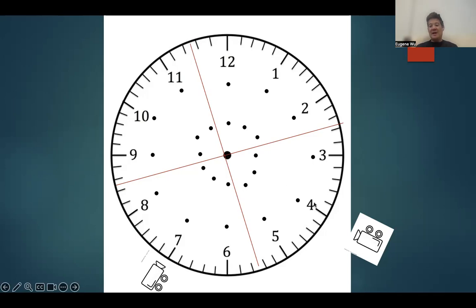clock. Okay, and our two fluoroscope cameras are at 4 o'clock and 7 o'clock. This is the 90 degrees apart, two camera angles. Okay, we have 24 possible wire positions. The wire can be at 12 o'clock, 1 o'clock, 2 o'clock, 3 o'clock, 4 o'clock, etc. It can be near the outer side of the vessel, or near the inner side of the vessel, giving you 24 wire positions. Okay.